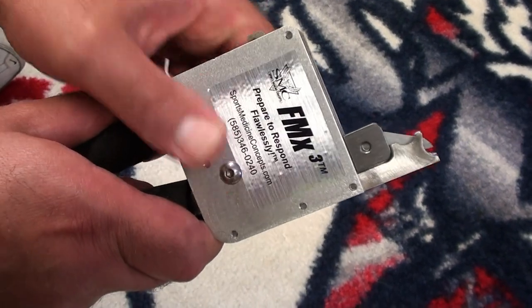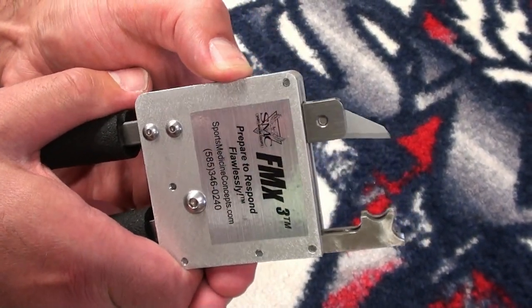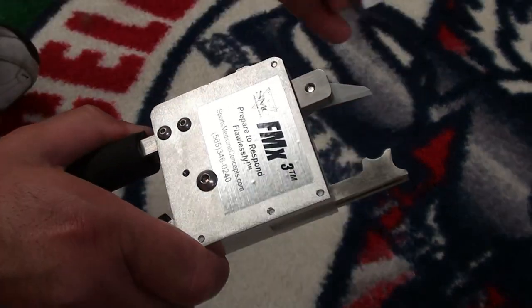With the FM Extractor completely closed, choose either the two- or four-step ratchet setting. Next, use the release lever to open the opposing ends of the FM Extractor and lubricate the blade with the FM Extractor lubrication wipe.